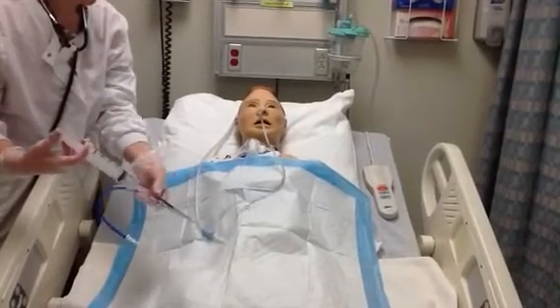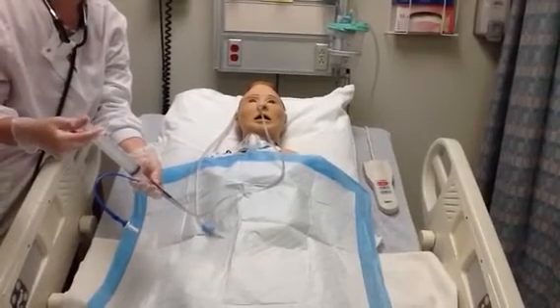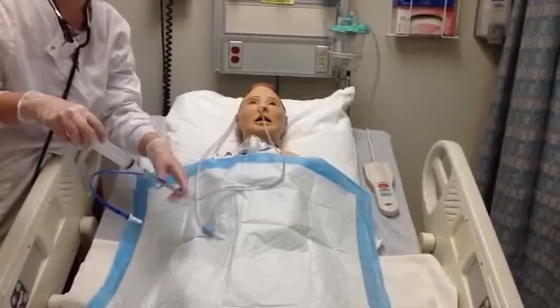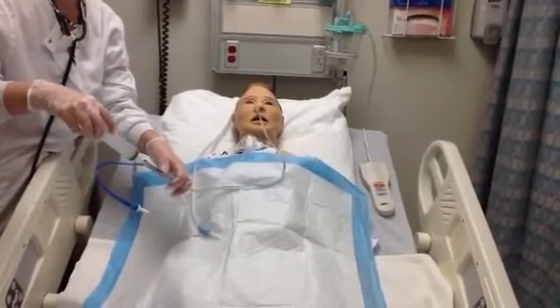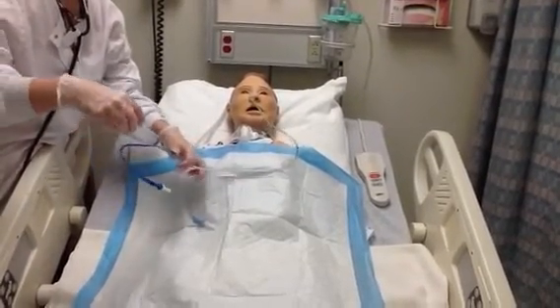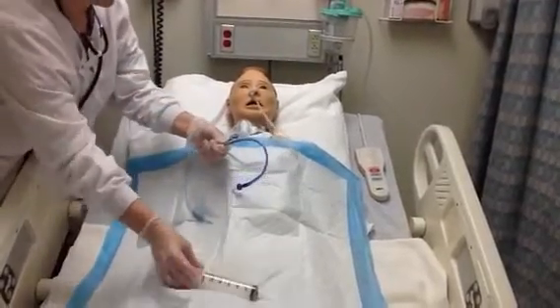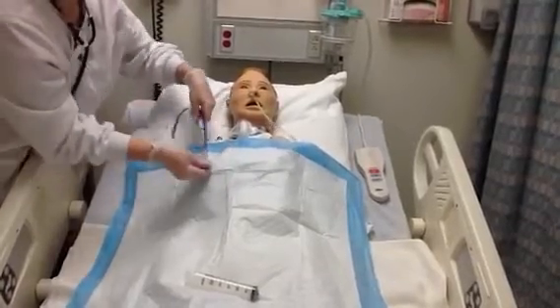If I get any gastric secretions, I will then inject that back into the patient's stomach. At this point, if there is a physician's order or the hospital policy, you may flush the NG tube, perhaps with 30 mLs of water or whatever is ordered by the physician. Okay, so I'm going to close that NG tube back off and connect my suction back on.